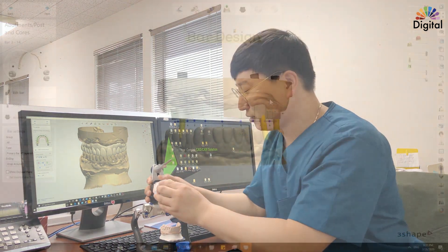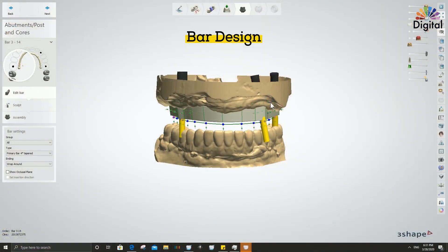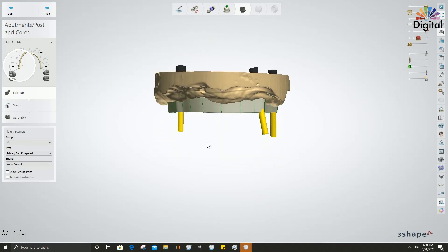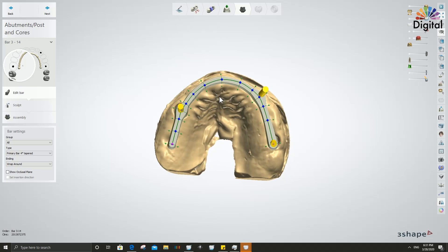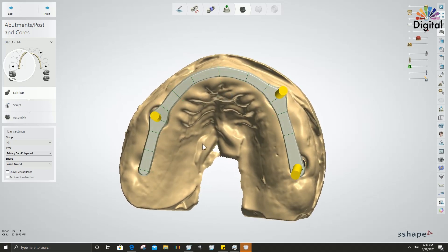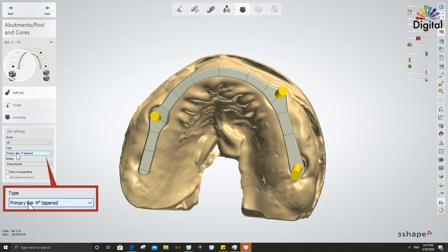For the bar design, I'm checking and making sure everything is correct. I want to make a tapered bar which has one insertion path on top, so we can see the top margin area and the bottom margin area. We have a four-degree tapered bar — a three-shape bar design called the primary bar four-degree tapered.